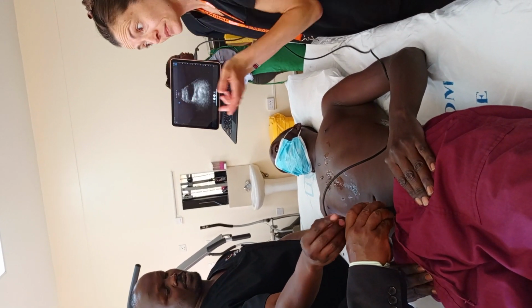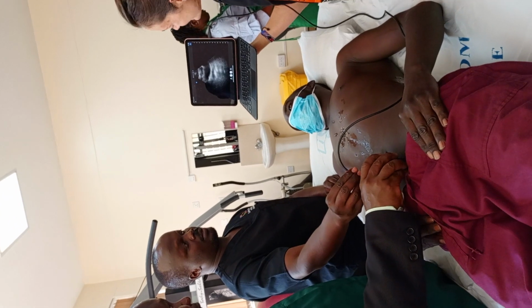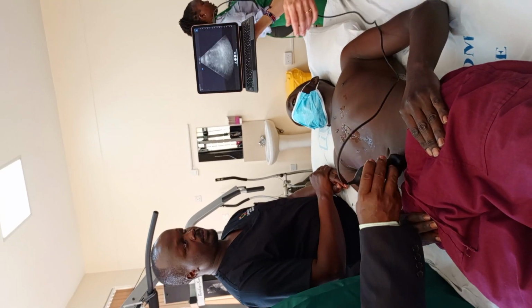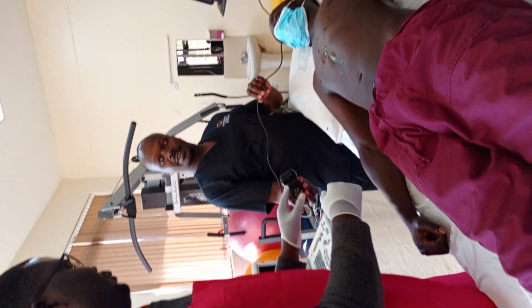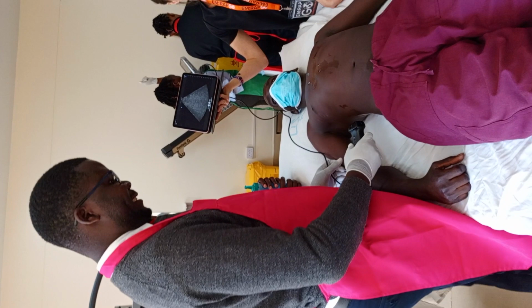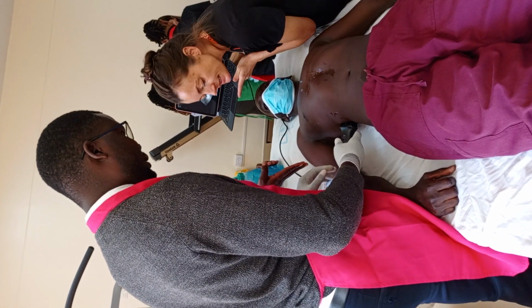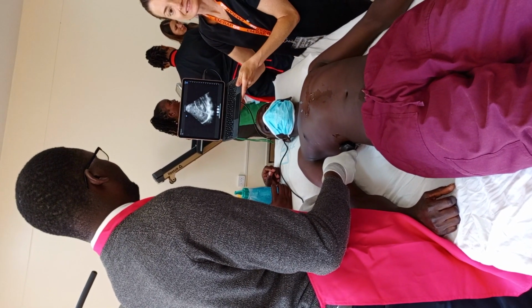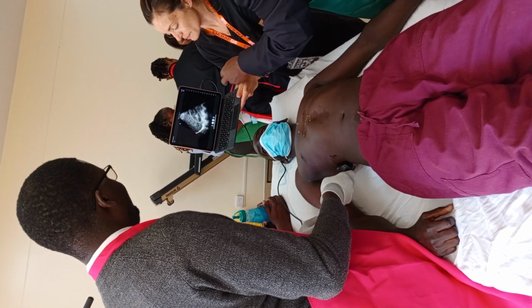And remember, where's your indicator? Is it? Oh, it is. Okay, good. Where's bladder? There it is. The top. Gorgeous. All right, perfect. Nicely done. Okay. How do you feel about that view? Where's your indicator? Yes, okay. Good view. Okay. Where's the liver? Can you point to the liver? Yes, where's the kidney? And where's Morrison's pouch?